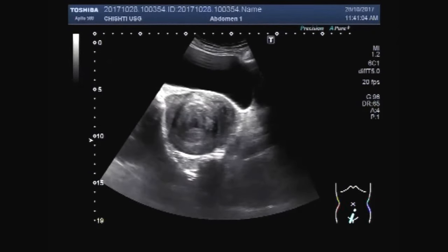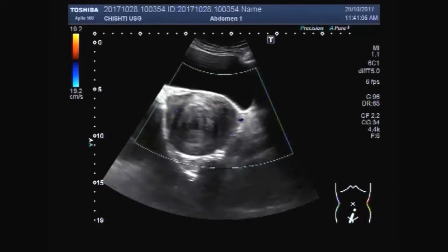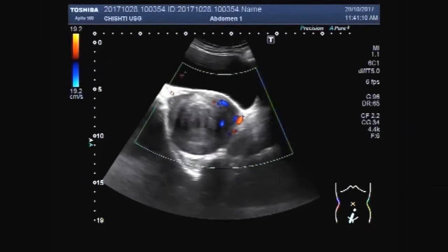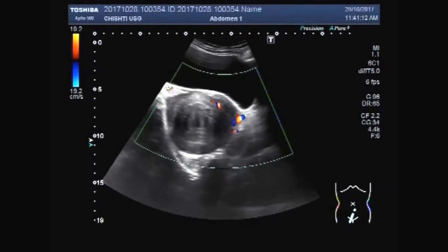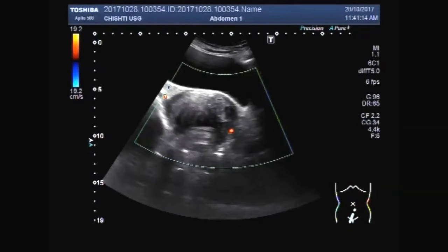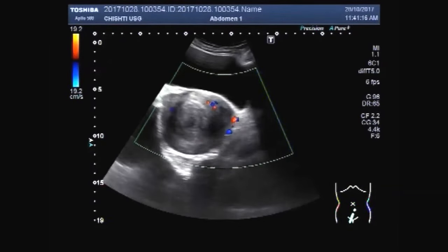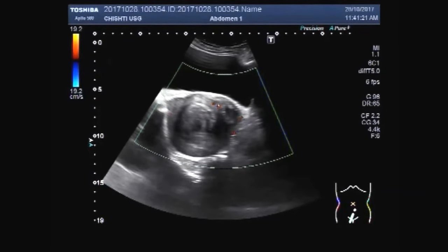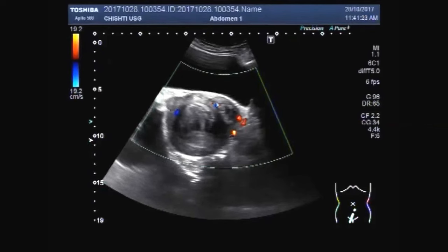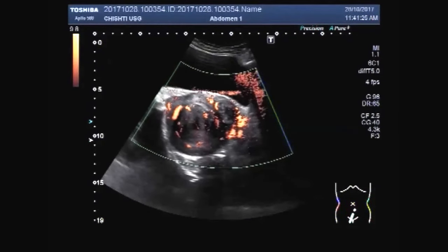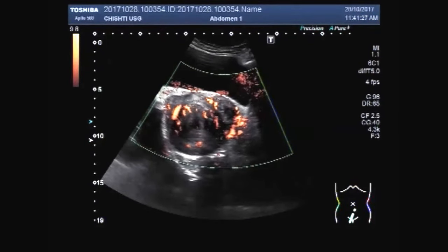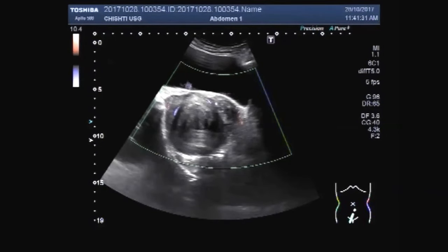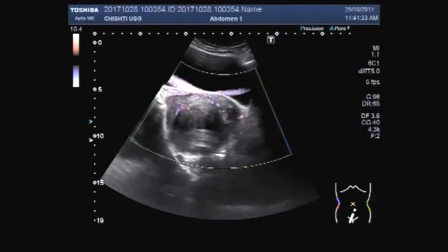The larger mass is round to oval in shape; the other mass is also round to oval in shape. A fair amount of blood flow is seen in the smaller as well as in the larger mass. Power color Doppler shows blood flow in the mass.